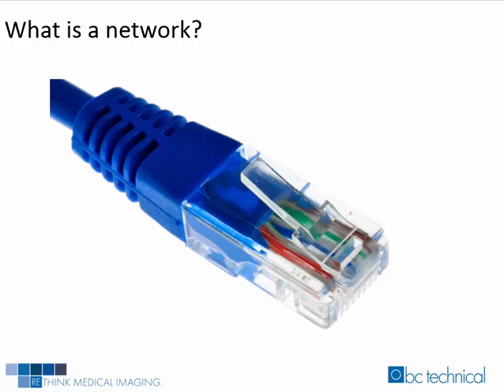A computer network is a telecommunication network that allows computers to exchange data in the form of packets. Networks are connected through Ethernet cables. There are other devices used in the network configuration worth mentioning, like switches, hubs, and routers too. Since this PowerPoint is for nuclear medicine technologists, we are going to elaborate on what is typically found in a nuclear medicine room.